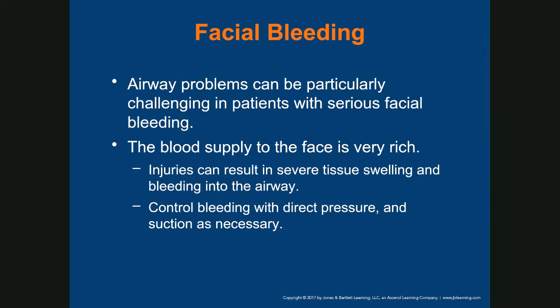And remember, if it's a lot of secretions, rigid suction catheter. Minimal secretions, flexible, right? Or if fluid is coming from the nose, or you can't create enough space in the mouth, then a flexible catheter would be a better option. And that should bring us to the end of this chapter.